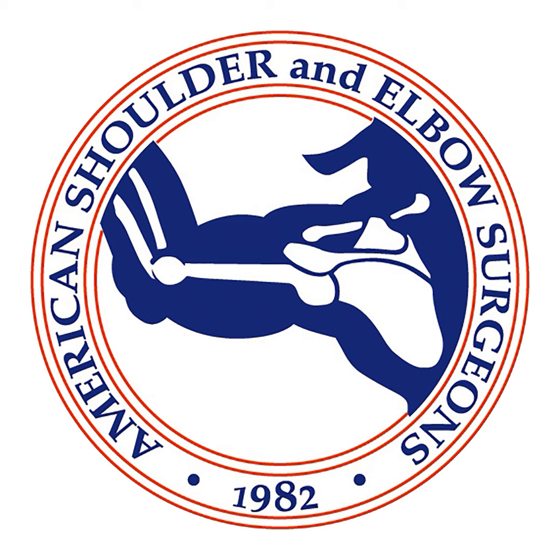Yeah, it's important to get a sense of the height of the lesser tuberosity. So I will take a second to outline the base of the bicipital groove, and then below the surgical neck with my cautery, and then I'll palpate it and get a sense for how big it is, and they do vary in size. Some patients have bigger lesser tuberosities than others. And then I use a broad curved osteotome, and I start in the base of the bicipital groove.